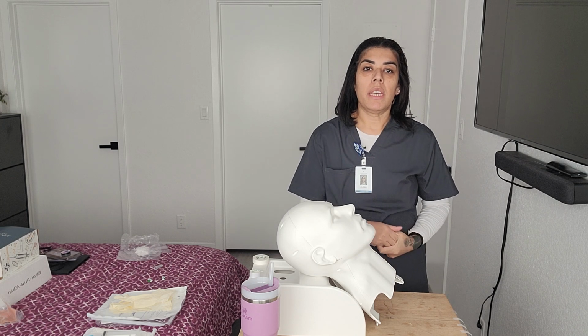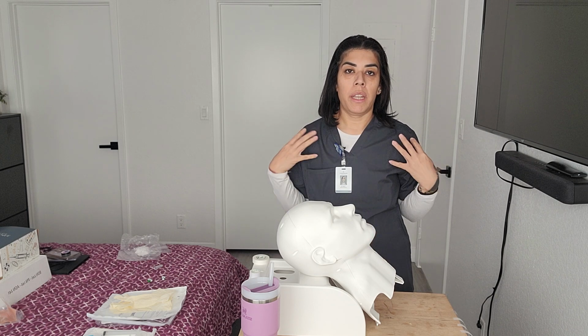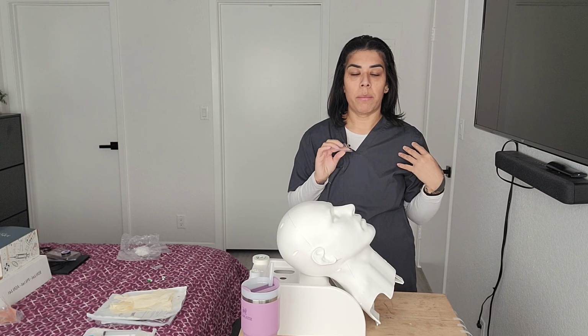Hello, today I'm going to be doing the NG tube insertion video. I am wearing the school uniform color along with my name badge.